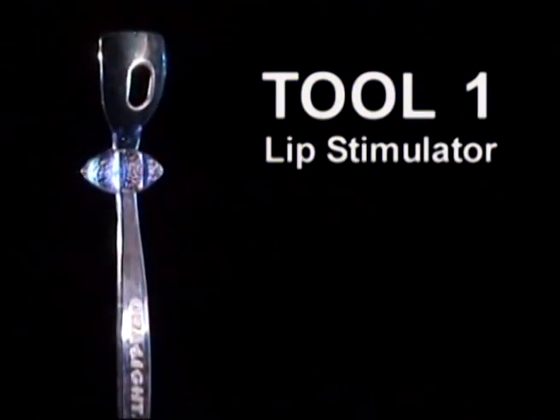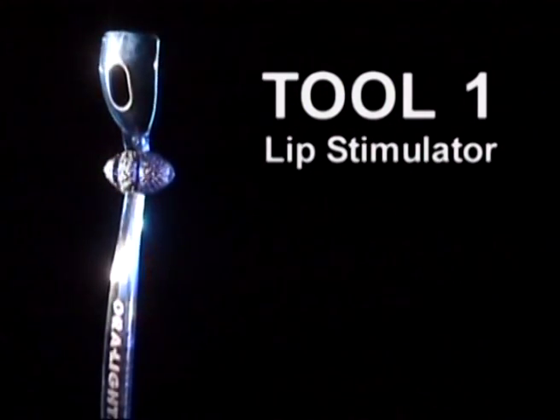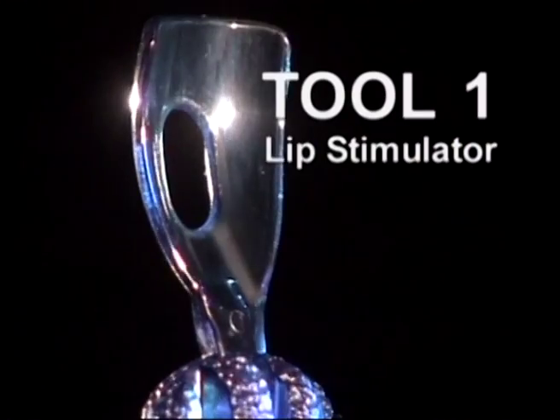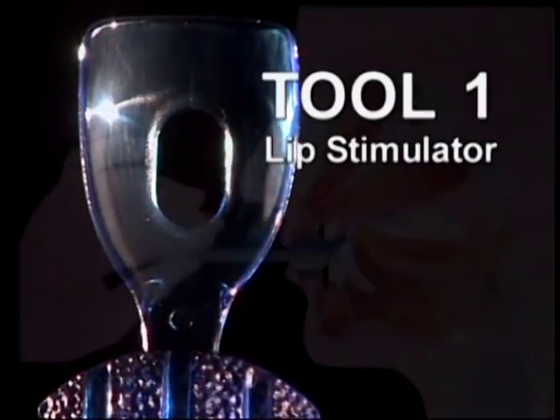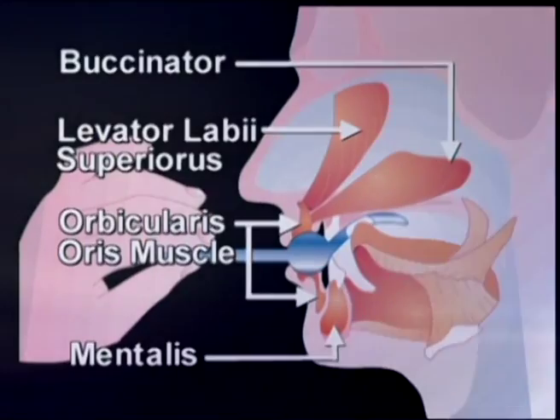Tool number 1 has a football shape on the handle with a textured surface. Also note the hole opening on tool number 1. This helps the patient feel where the tongue tip should be placed, guiding the patient to position the tongue tip on the palate behind the front teeth when speaking and swallowing. Muscles exercised include orbicularis oris, mentalis, levator labii superioris, and buccinator.